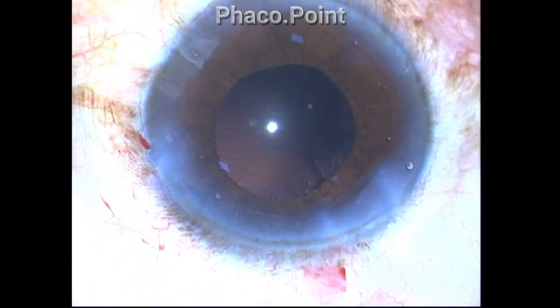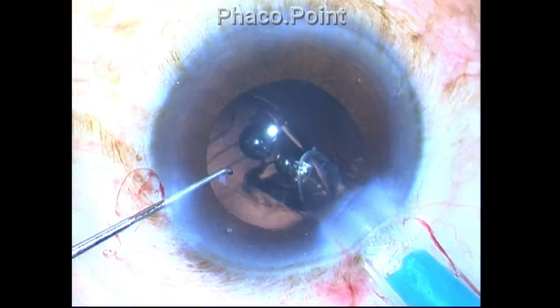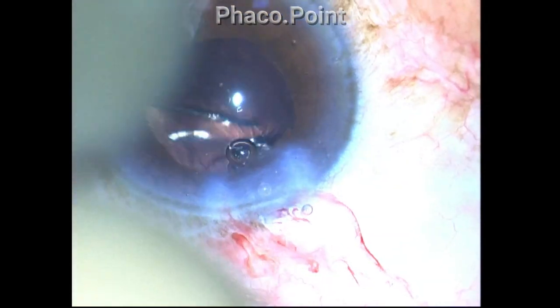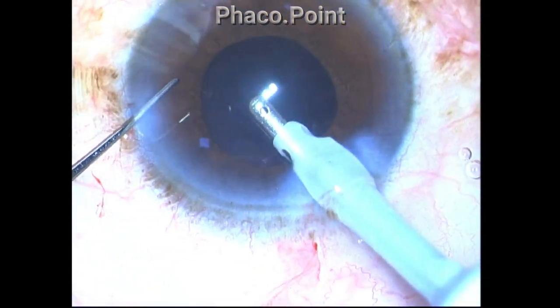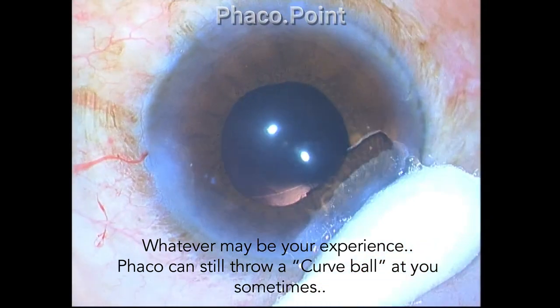Well, the rest of the procedure went on without a hitch. The intraocular lens was implanted uneventfully. And I finally emerged from this surgical experience with the knowledge that however much experience and however many cases you might have done, phacoemulsification can sometimes throw a curveball at you.